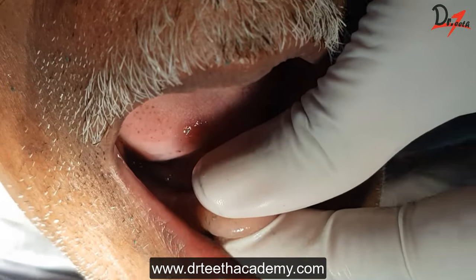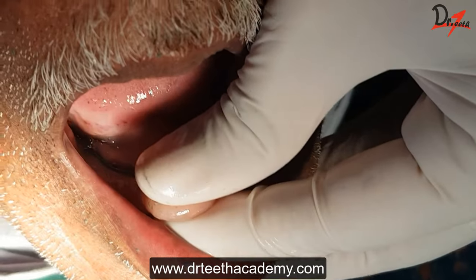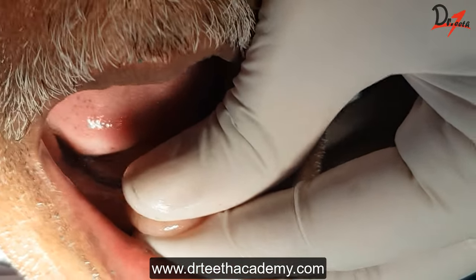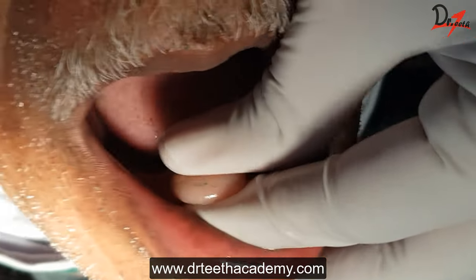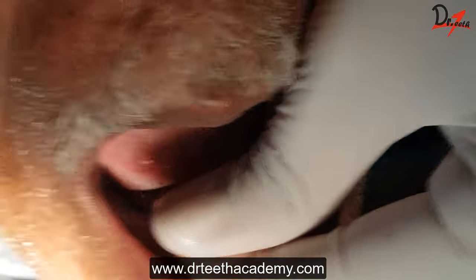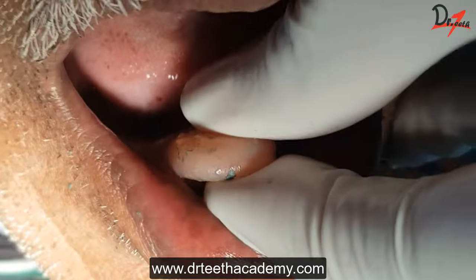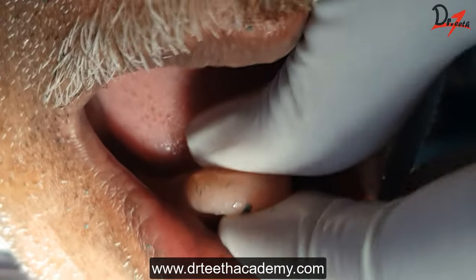Retention and stability is very critical for our dentures and it is difficult to get it in the mandibular dentures, obviously because of the less surface area of the mandibular ridge and the mobile mandible. Nevertheless, it is possible if you follow the correct method and practice it. In this video I will be demonstrating the method of mandibular border molding.